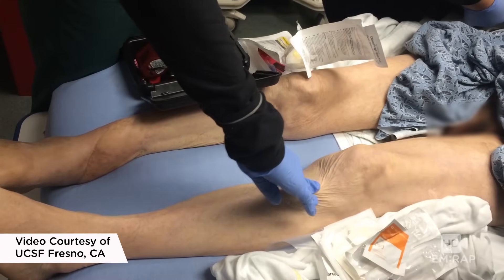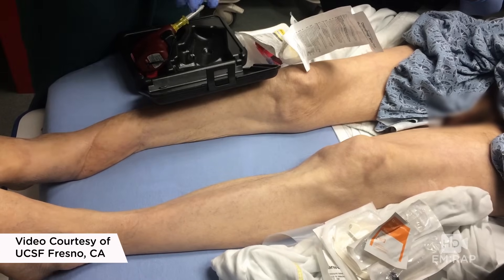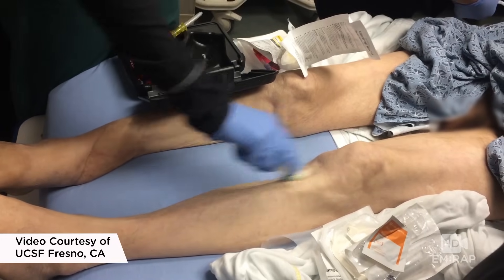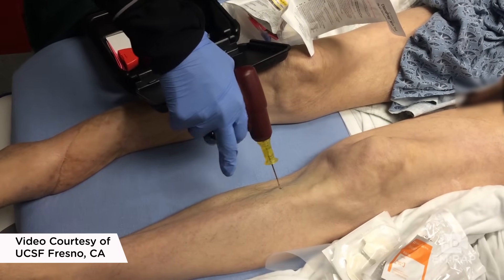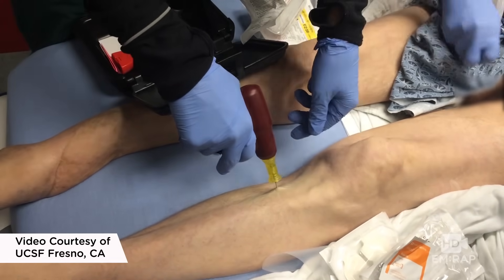For the proximal tibia, you want to feel two finger breaths below the tibial tuberosity and you're going to go on that anteromedial surface. So you're going to prep the skin first. Now with your drill — here they're using the yellow one; the blue would also work. Yellow might be a little long, so you just don't want to hub it. You're going to advance it through the skin and then drill until you feel give. That's how you know you're in the medullary cavity.